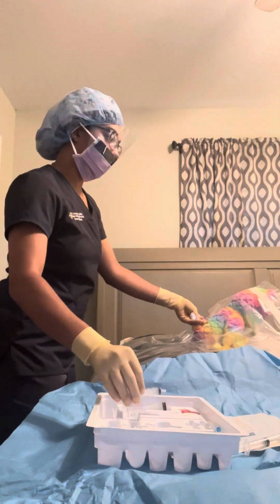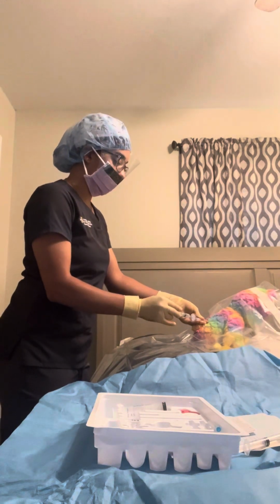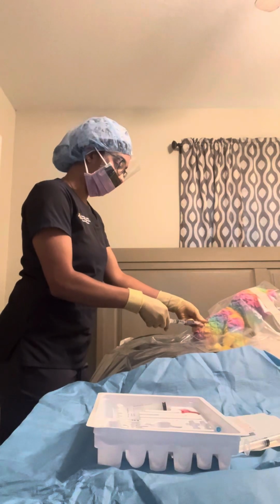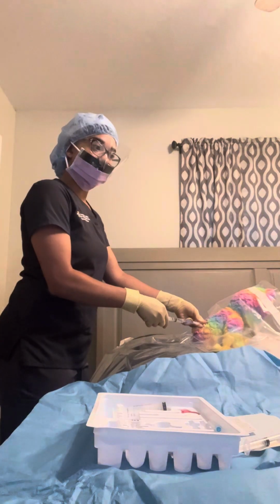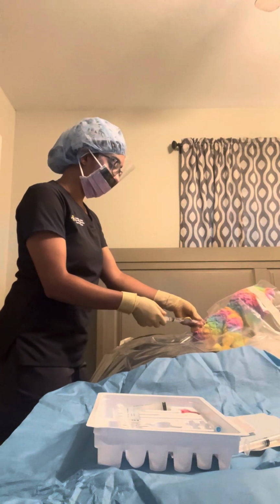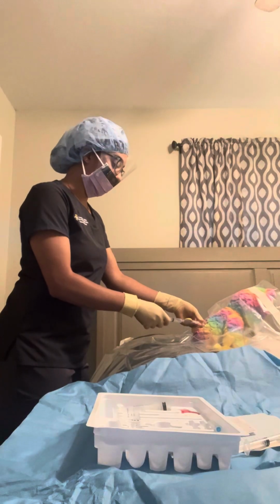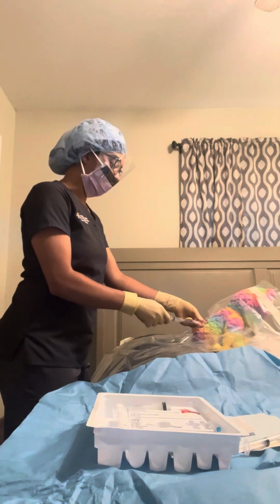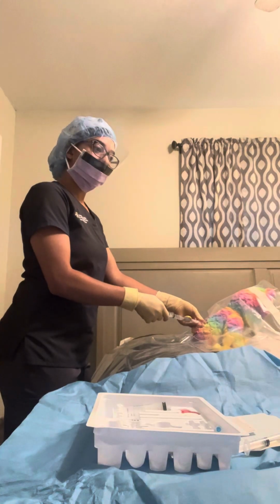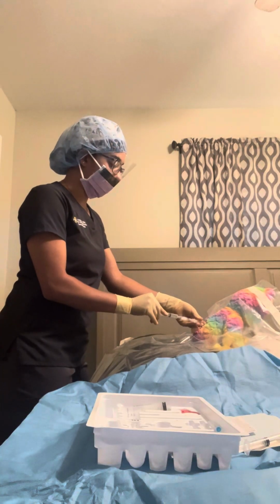I am now going to attach my 5 cc syringe with my lidocaine and epinephrine test dose and do an aspiration, making sure that I am negative for blood or CSF. After negative aspiration, I'm going to administer 3 mils of 1.5% lidocaine and 1 to 200,000 of epinephrine. Test those through this filter.